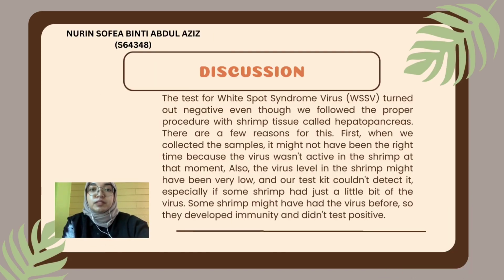Hi, my name is Binti Abdulaziz, S64348. Today we will discuss the results that we gained from the test kit that we did, which is white spot syndrome virus, and it turned out to be negative. Even though we followed all the procedures, there might be a few factors that led to the negative result. The first factor is that it might not have been the right time when we collected the samples, which means that the virus is not active yet, and the second is that the level of the virus is too low for the test kit to detect it.